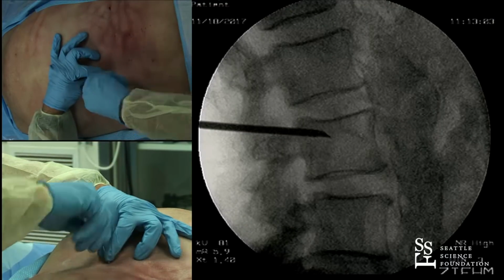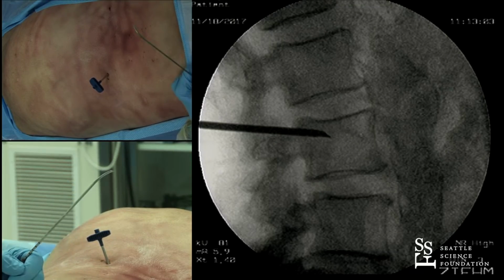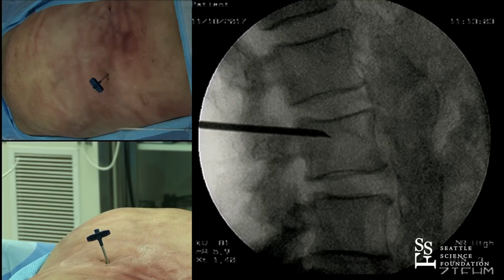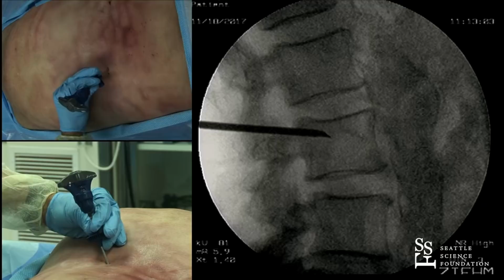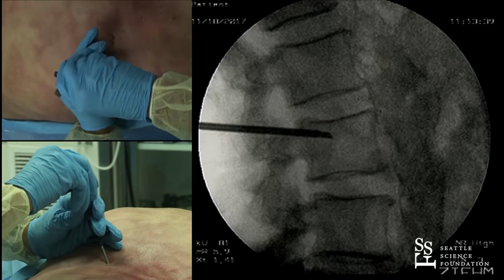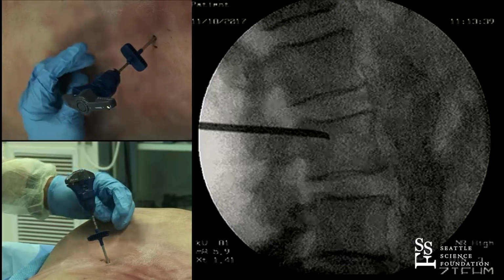And so what we'd like to do is just remove the stylet, and we will insert the directional needle. This has an actuator here, and it goes away from the face of the bevel here, so it accentuates the normal steering capabilities of the needle away from the face of the bevel, so it bends just like you would bend your spinal needle whenever you're approaching a transforaminal or whatever you're trying to do. So we'll put it just inside the cannula, and we'll make a little turn. And it has an external marker as to the direction of this. So this is going medially and slightly inferiorly.